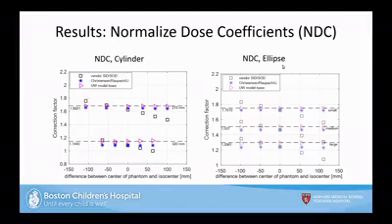So yeah, actually, the previous study was just to confirm their results, and going forward it made us confident that we could compare ours to theirs. I was really just confirming our extraction method, so that we knew going forward that we could use patient data. We were confident that our extraction method for the CT localizers would work, and also for the CT axial images.